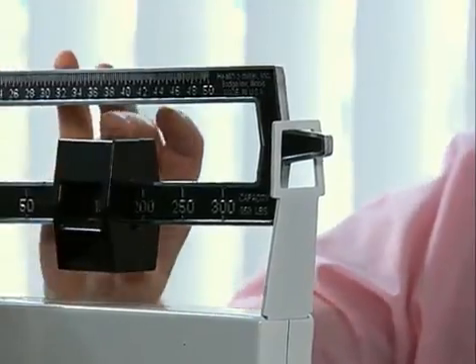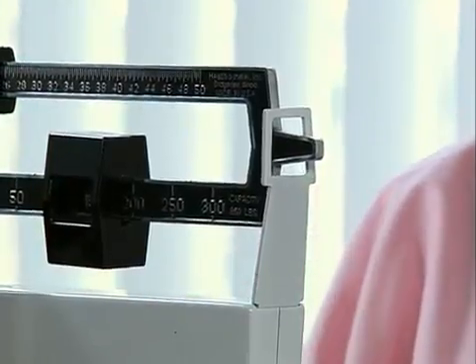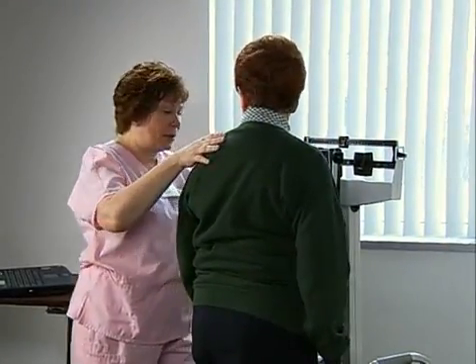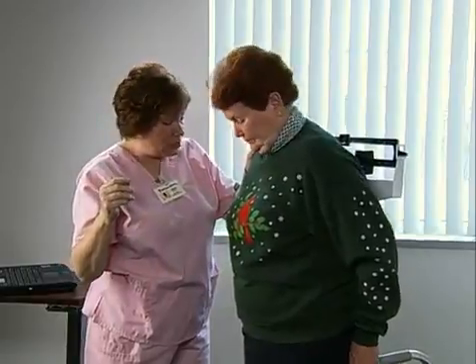Adjust the weights on the scale until the pointer balances in the middle. Record her weight according to facility policy. Miss Penny, may I get your height? Measure the patient's height by asking her to turn and stand with good posture. Provide balance if needed as the patient turns on the scale.